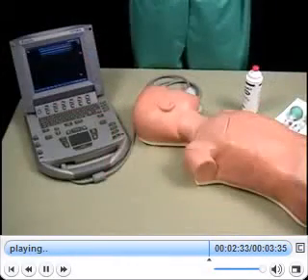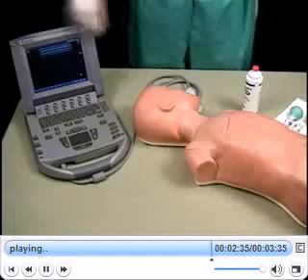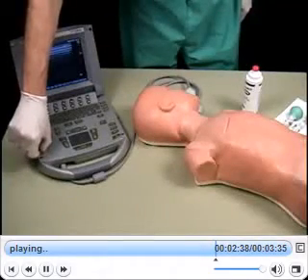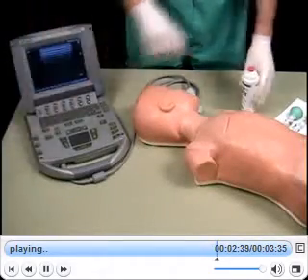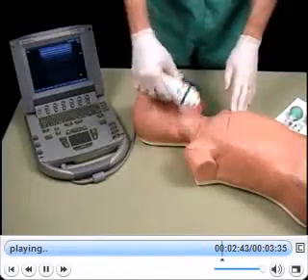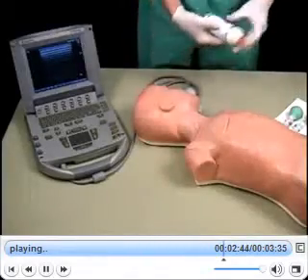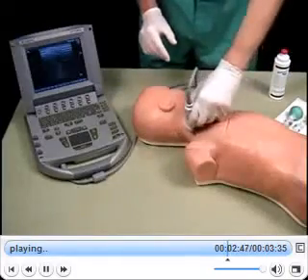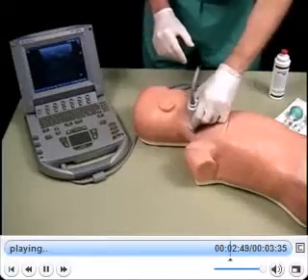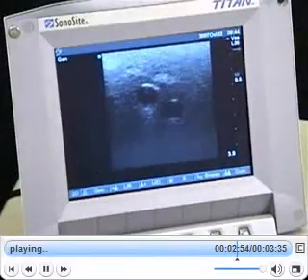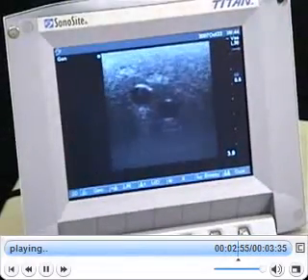An ultrasound imaging unit can be incorporated into this procedure. Begin by turning up the gain on the ultrasound unit and applying gel to the tissue before proceeding. Search and find the vessels on the imaging unit. Notice the realistic appearance of the tissue, vessel walls, and contrasting fluid-filled vessels.